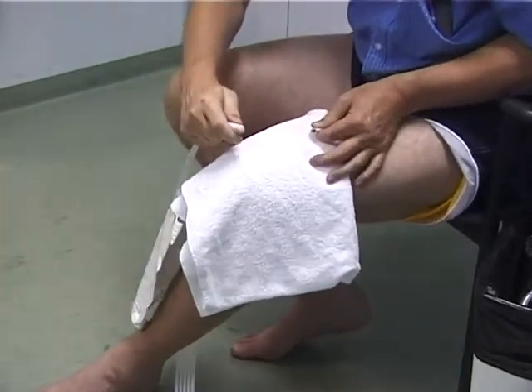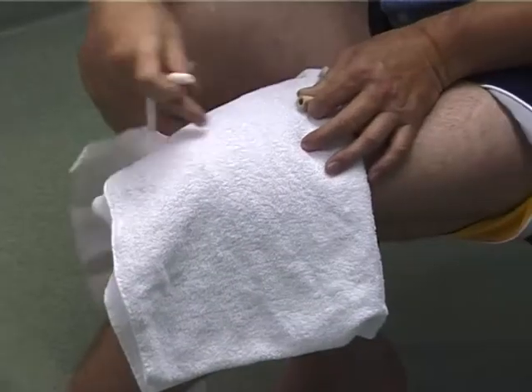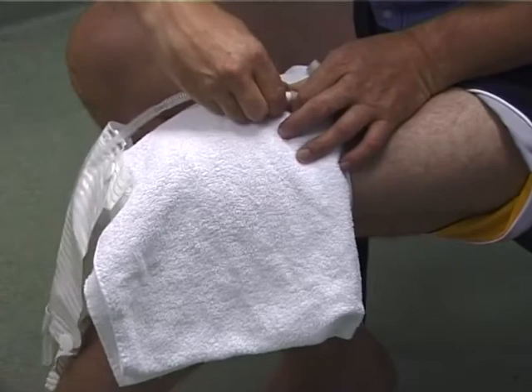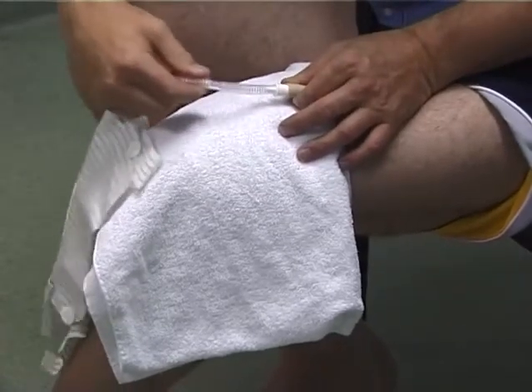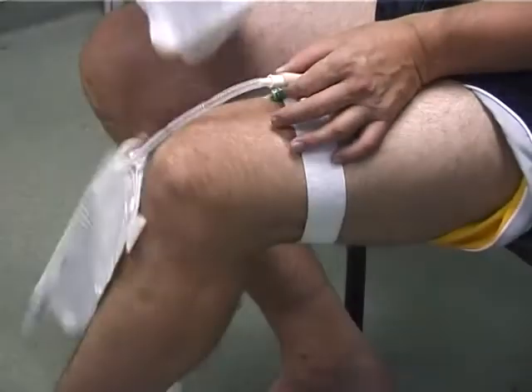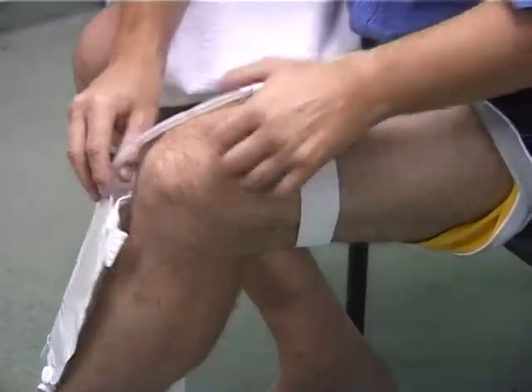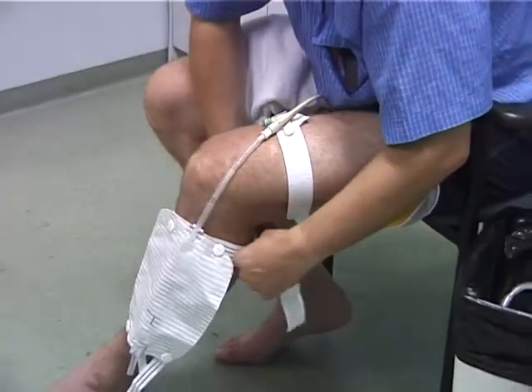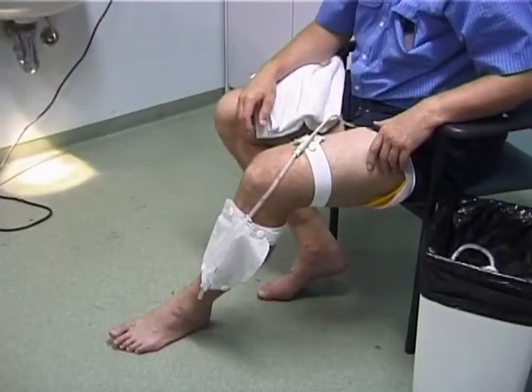Then reconnect a new bag and ensure that it is tightly in place. Then reconnect the leg bag straps to the leg. Leg bags need to be changed every 7 days.